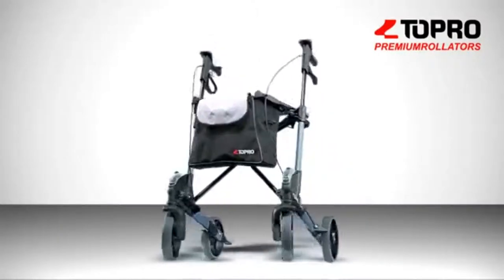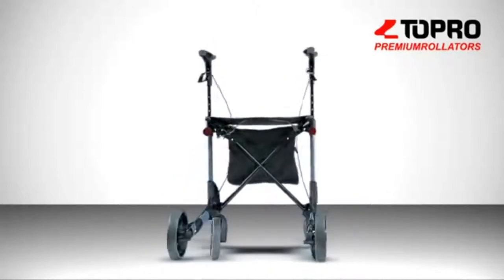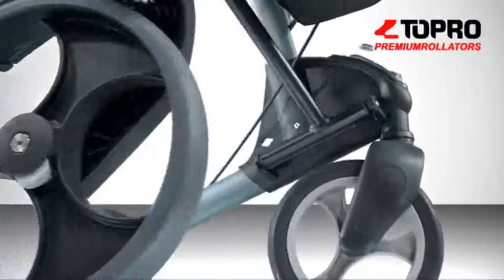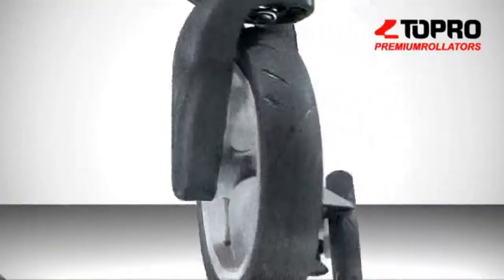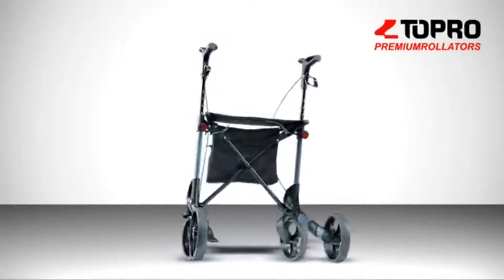The Topro Troja 2G is a consistent further development of the award-winning Topro Troja. We listen and respond to our customers' needs. The Topro Troja 2G now has new ergo grips and a simple-to-use wheel change function.